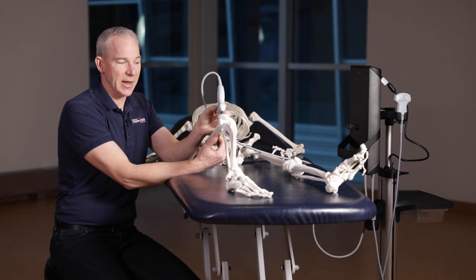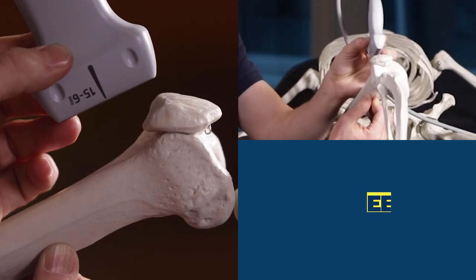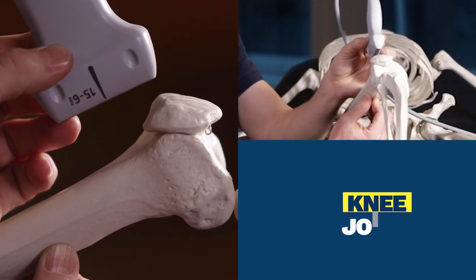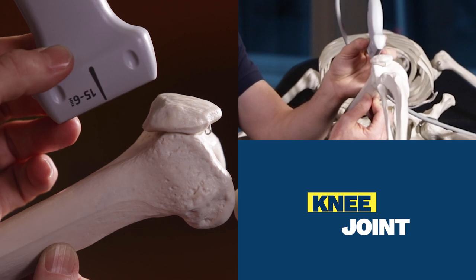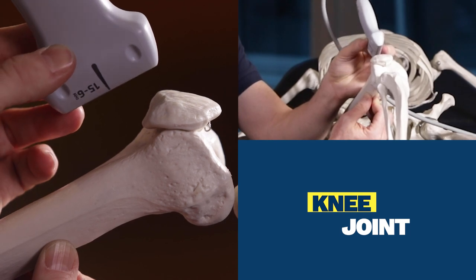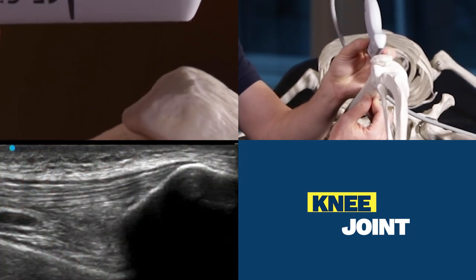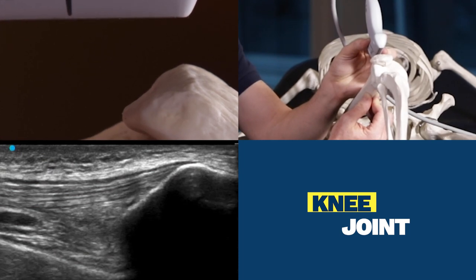The patient position is supine with approximately 30 degrees of knee flexion. The landmark is going to be the proximal pole of the patella, and the orientation of the ultrasound probe is going to be long on the femur. The movements are going to be slight angulations of the probe until the femur shines nice and bright, in addition to the proximal pole of the patella shining nice and bright.